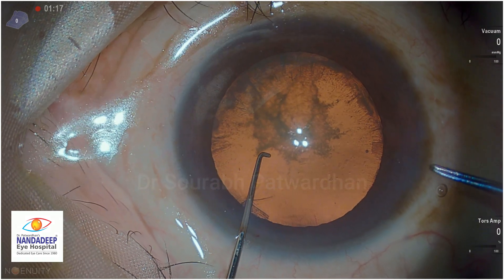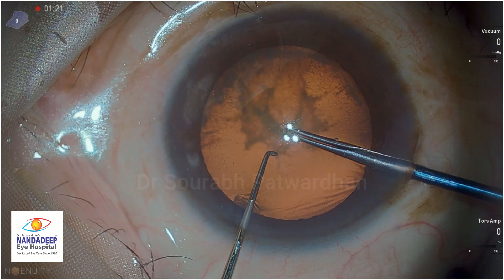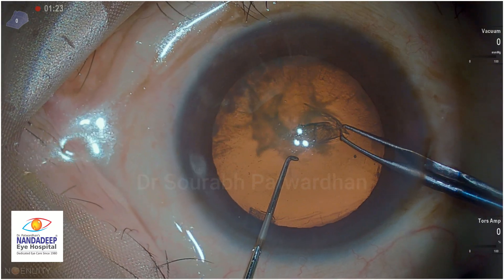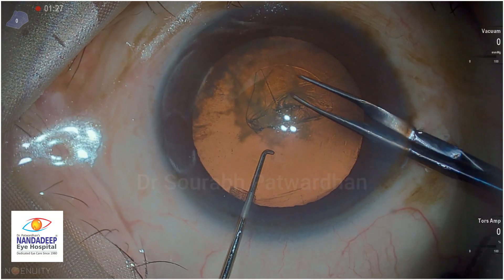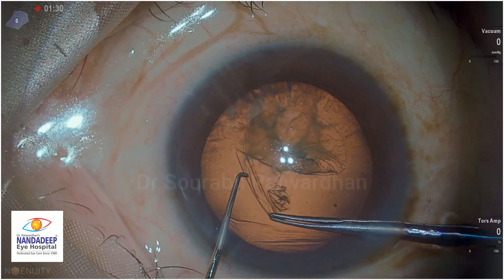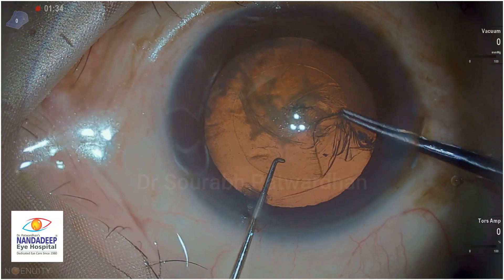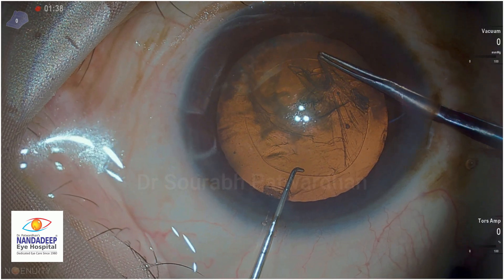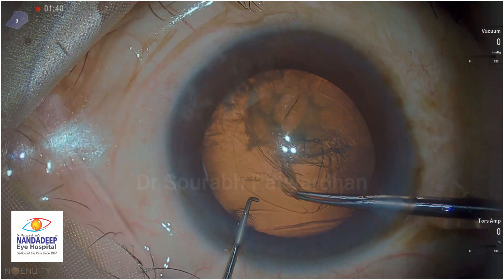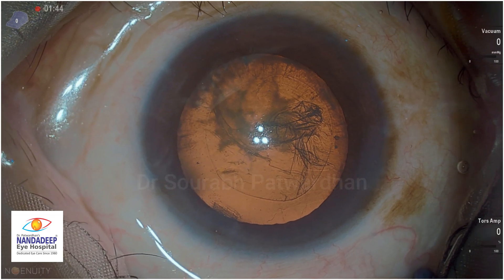Let's begin this soft cataract. You can see I have already made incisions and am using the Haldipurkar Capsurexis forceps. I always use dispersive agent Hylucote for my capsulorrhexis and want to make a good 5mm rexis. For all cases, it is important to have 5mm capsulorrhexis. If you do 4mm or less than that, you are stuck with that small rexis curve.